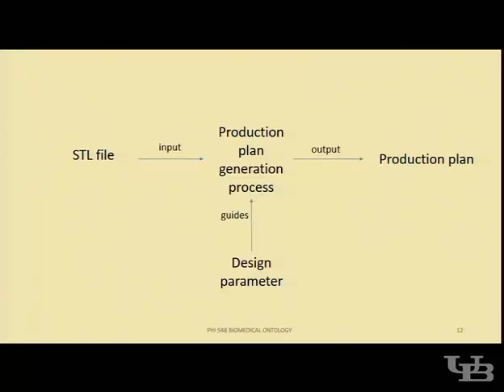The design parameter could be in terms of the angle of the product, the gap, and also other types of parameters for the production plan to be generated.